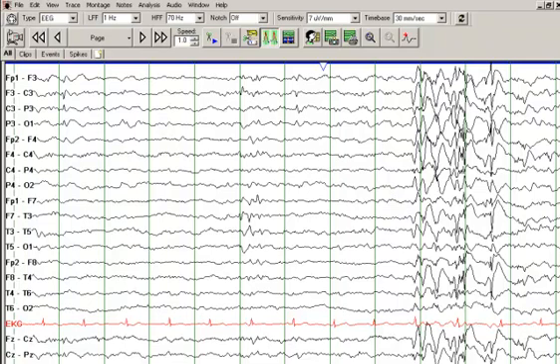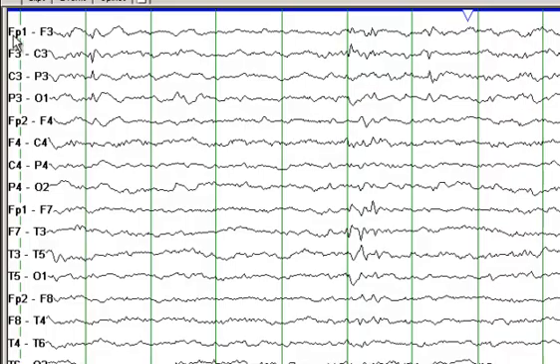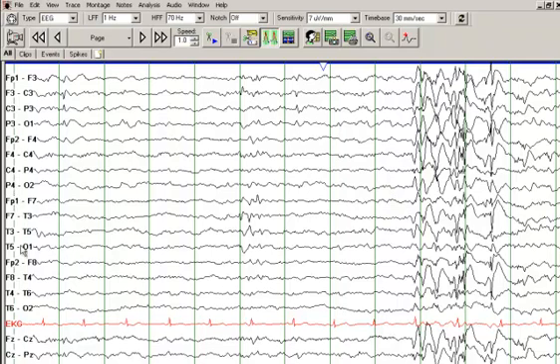Let's start with the EEG here — these are the EEG reading rounds. Just a quick recap: electrodes which end with an odd number are recording from the left side of the brain; electrodes that end with an even number are recording from the right side of the brain. The alphabets designate the location of these electrodes: FP is frontopolar, C is central, P is parietal, O is occipital. This is an EKG lead. FZ, CZ, and PZ are midline electrodes.